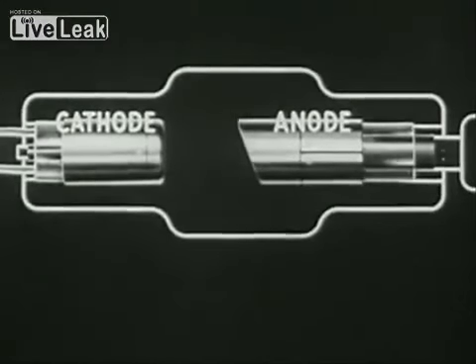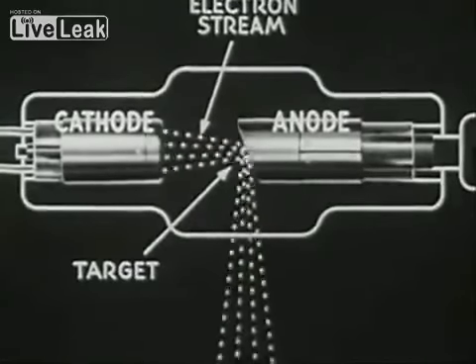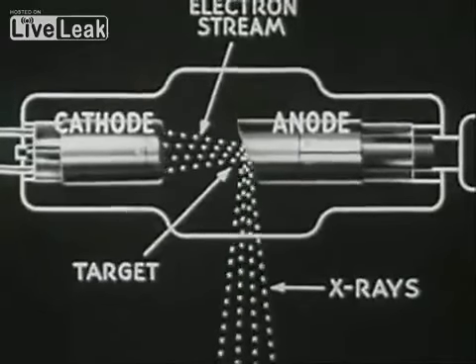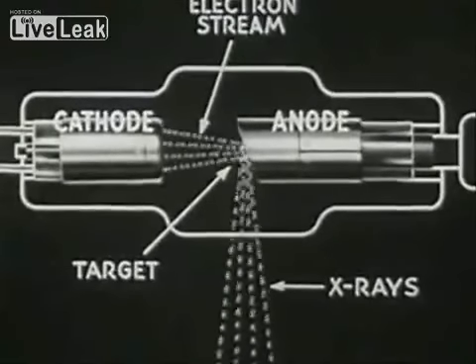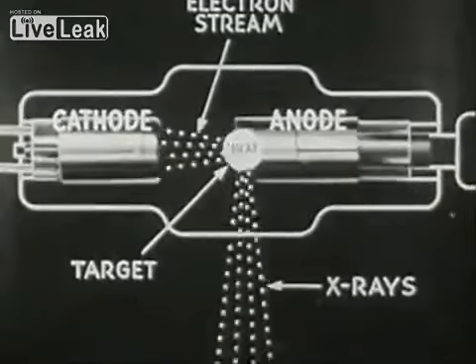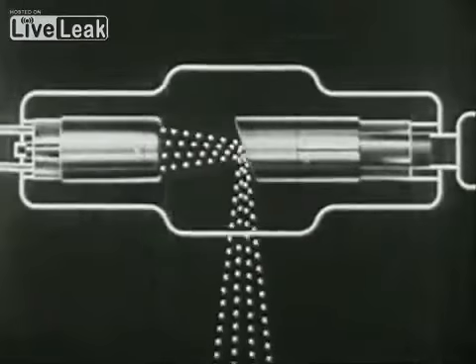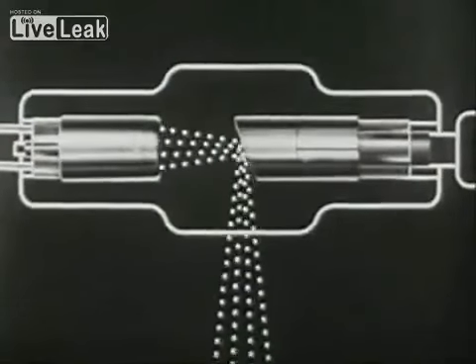It seems that the electron stream striking the target at terrific velocity is stopped so violently that the electromagnetic radiation known as X-rays is produced. The efficiency of X-ray production is very low, and most of the energy of the electron stream goes to heat the target. This heating effect of the electrons may be likened to the flame of a blowtorch striking a metal plate, while the light coming from the heated spot on the metal plate target corresponds to X-rays coming from the focal spot on the target of the X-ray tube.